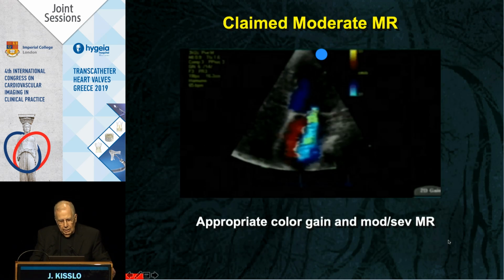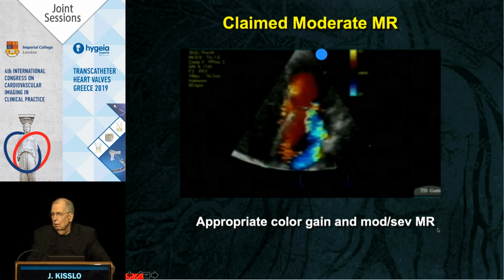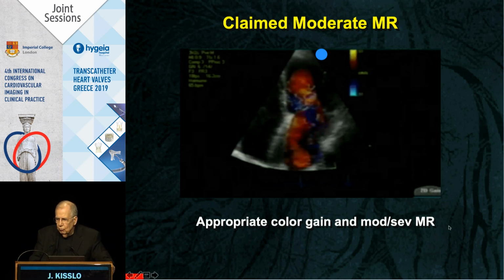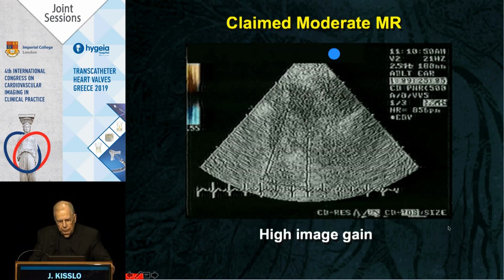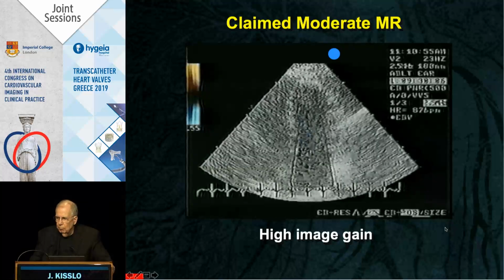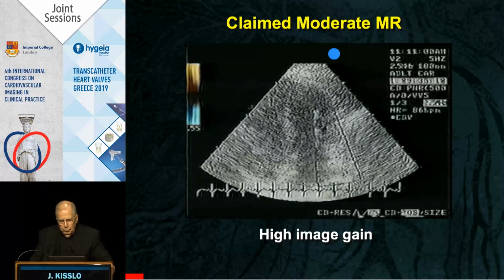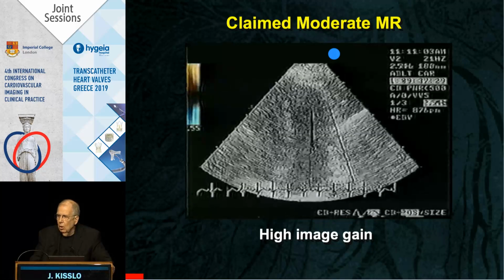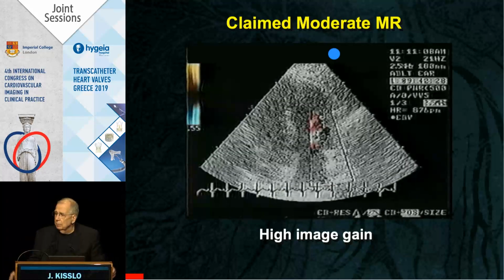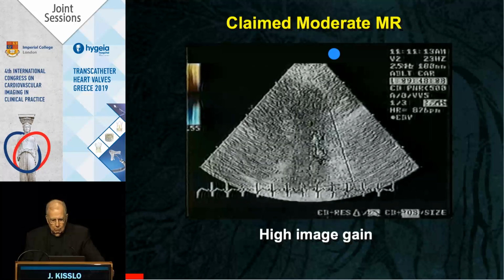When you look at one of the claimed mitral regurgitations, I think you'd say that's legitimate. Let me show you an example of what was submitted, approved and awarded $250,000. Look at that echocardiogram, done by board-certified people, gone through the core lab, and approved. To me, this is remarkable. Let's look at the reasons why, particularly you folks, the surgeons and other people involved that are not echo people, to look at what you need to look at in the echo.